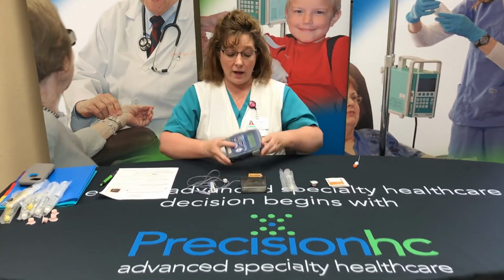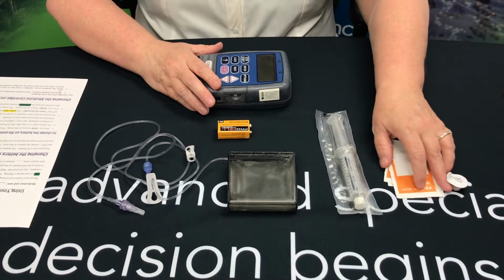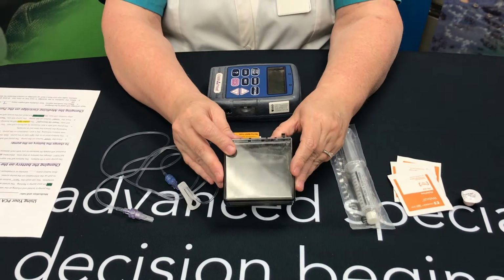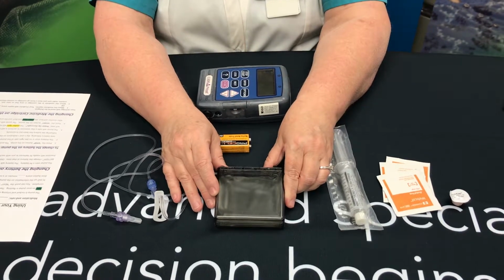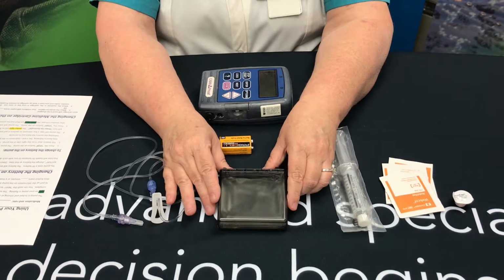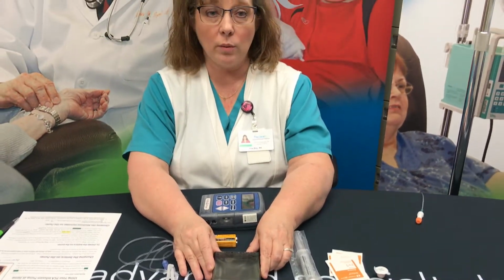We need our backup pump, we need a battery, we have a saline flush, and some alcohol pads, and then we need our new cartridge of pain medication. We will make sure that we deliver a new cartridge for you in ample time so that you will not run out of pain medication at any time. If at any time you notice that you're running low and you do not have a backup cartridge, call us and we'll make sure that you get one as soon as possible.